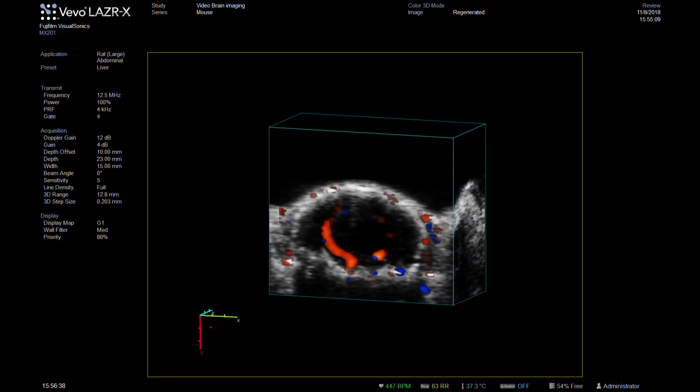For example, if you are imaging a tumor, you can assess angiogenesis and follow its behavior over time.